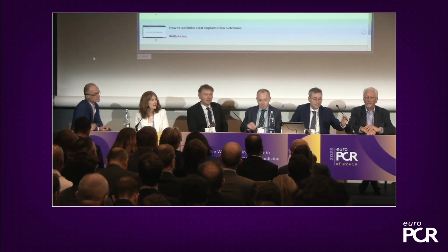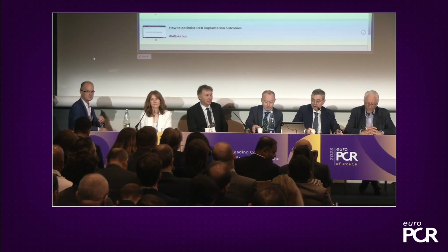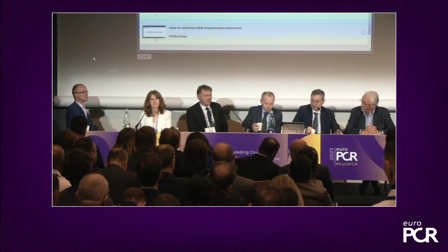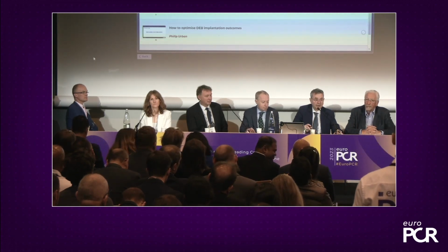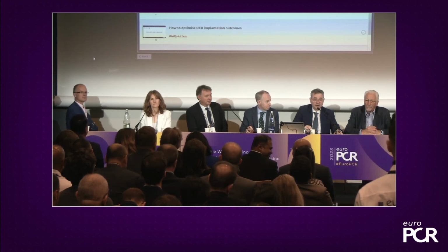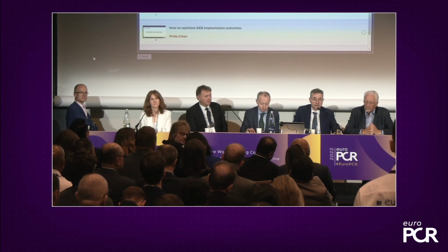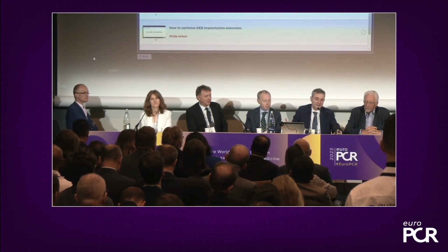Yep. We have one comment that showed up on the chat, and the question was: in the protocol, is a 30% residual stenosis assessed visually or by QCA in the cath lab? And the answer is it's visual in the protocol. And obviously we have a core lab looking at all the procedures and calculating the residual stenosis after vessel preparation, but that's after the case.